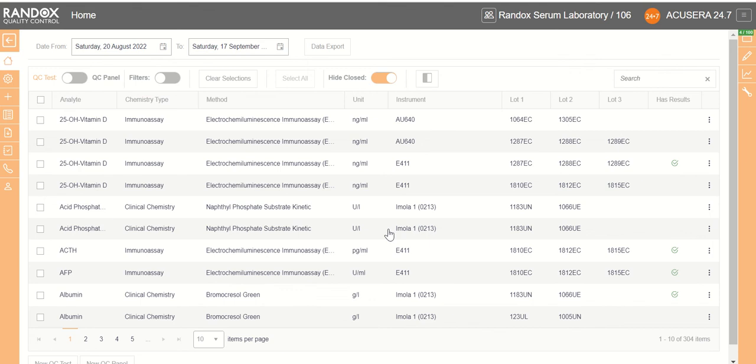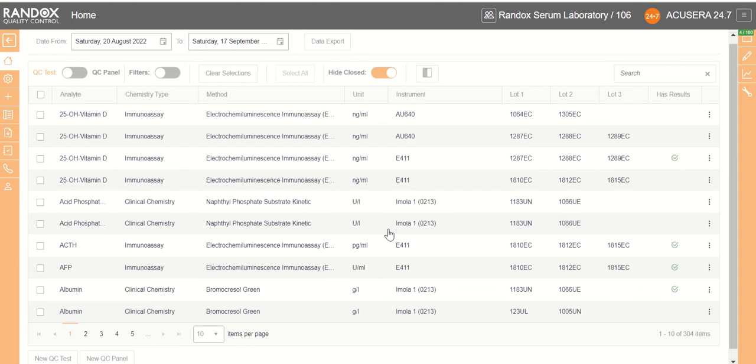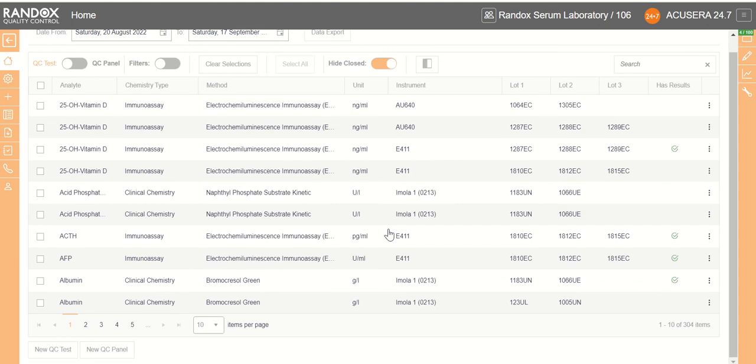Hello and welcome to this part of the Randox AccuSera 24x7 training series. In this part we're going to be looking at the addition of a new QC panel. A QC panel is our way of grouping QC tests together.